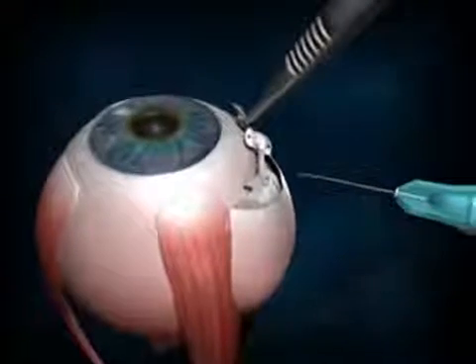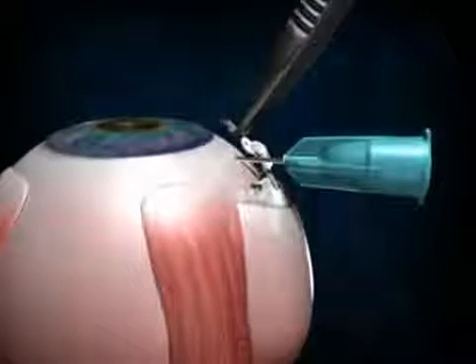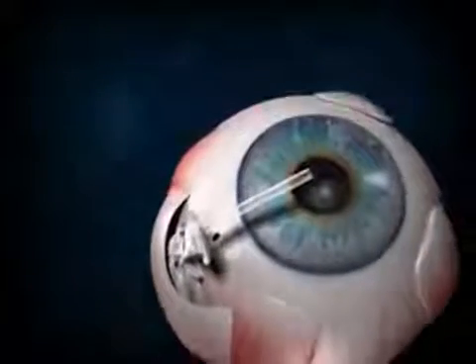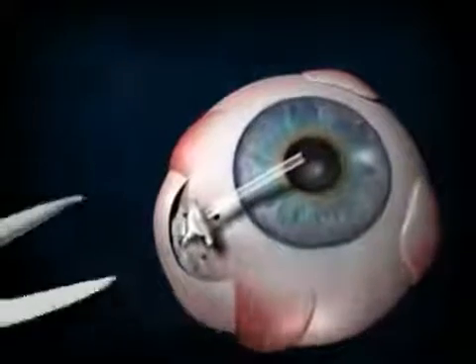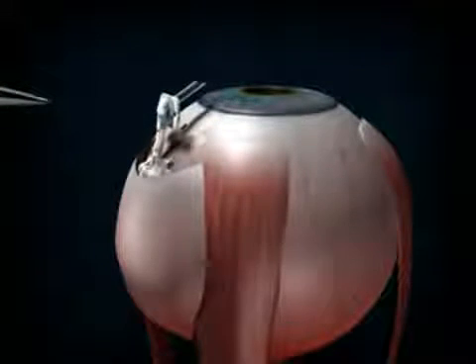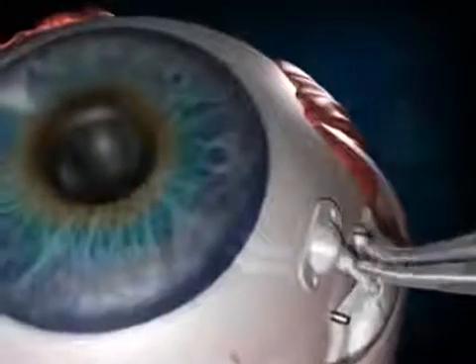Placement of the tube in the pars plana. Using a 23-gauge needle, make a needle track about 3 to 4 millimeters away from the limbus where the partial vitrectomy has been performed. Measure the tube to be 3 to 4 millimeters from the needle track. Take sharp cutting scissors and cut the tube beveled upwards. Dispose of the excess tube. Move the clip over the tube so that the end of the tube can be inserted into the 23-gauge needle track. Make sure that the implant tube is placed in the area where the partial vitrectomy was performed.